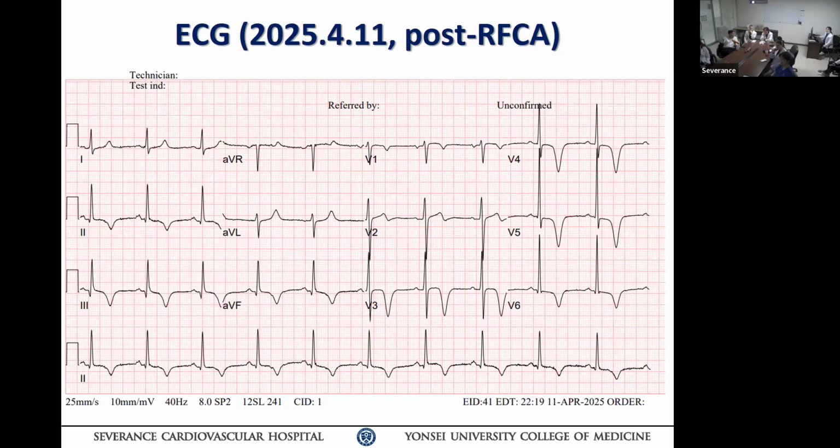Is this after rapid V pacing? This was... Actually, I did not see the patient, so I am not 100% sure of the situation.